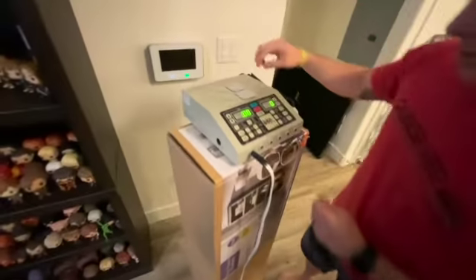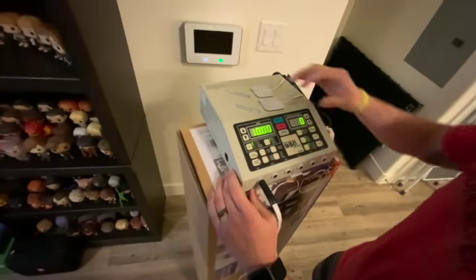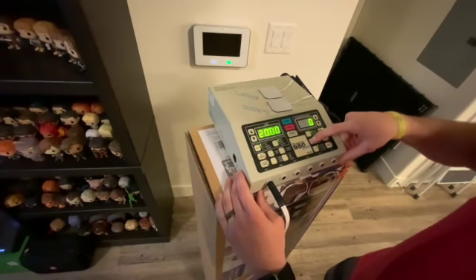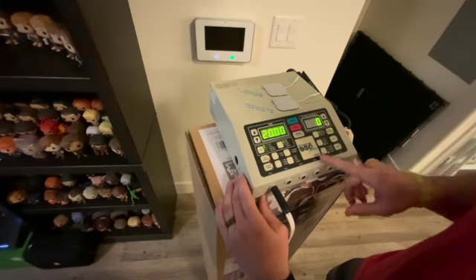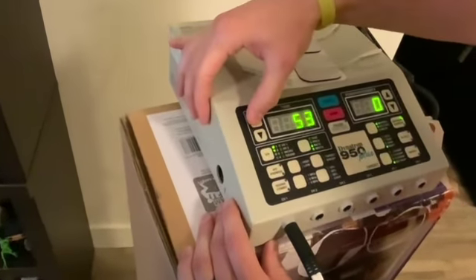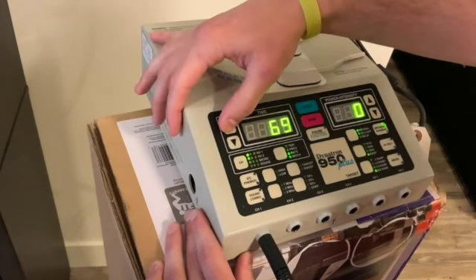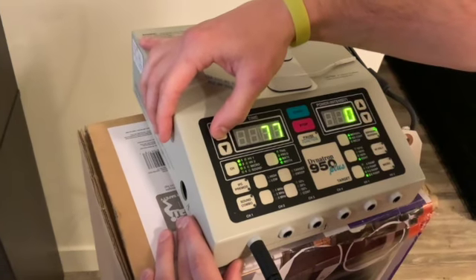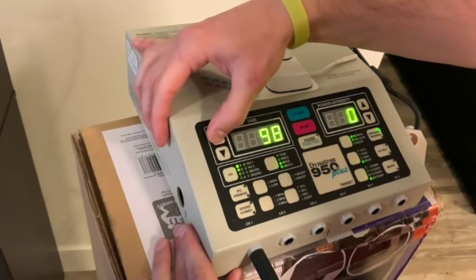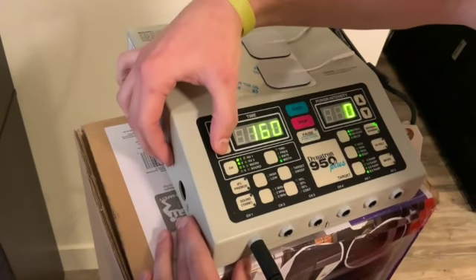That's good. Okay, so we're going to do a biphasic pulse current, and I'm just going to bump up the time here to 20 minutes. You're going to put this on continuous, and then just a ramp time of 2 seconds. For the rate, I'm going to move it up to 100, so we have a more smooth pulse and everything. And then for the width, I'm going to go down to 100 as well.